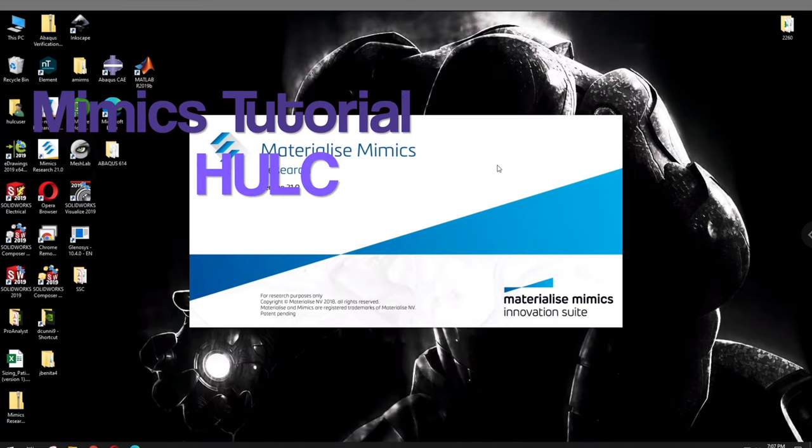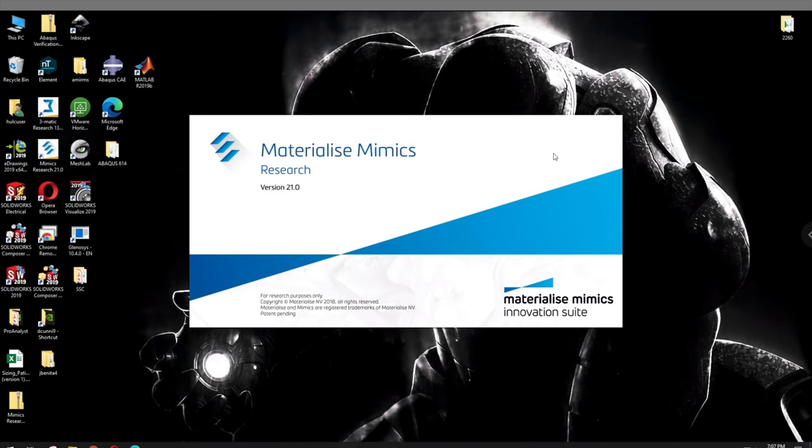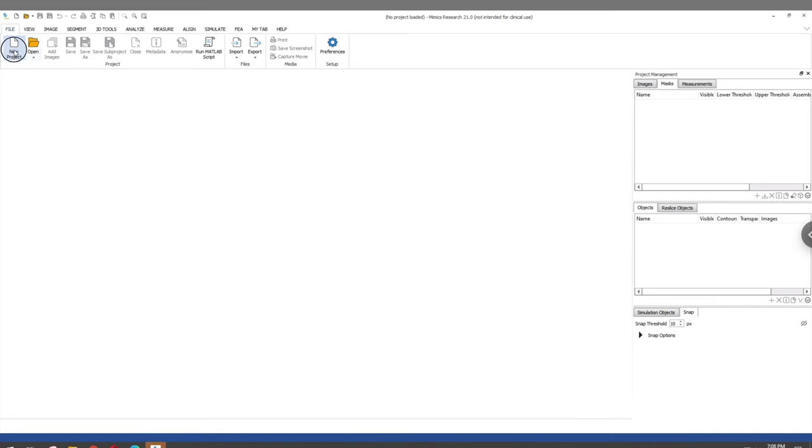So welcome, I'm just going to be doing a brief tutorial on using Materialise Mimics to create 3D models of, in this case, a humerus. As we open up Materialise Mimics here, I'm just going to go through briefly opening up the document.